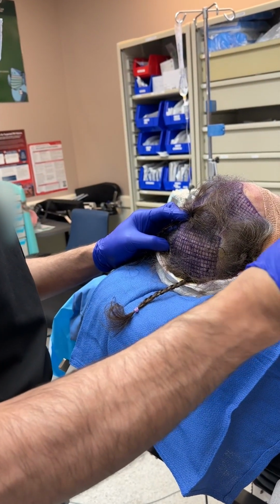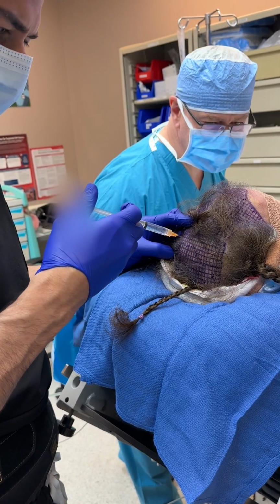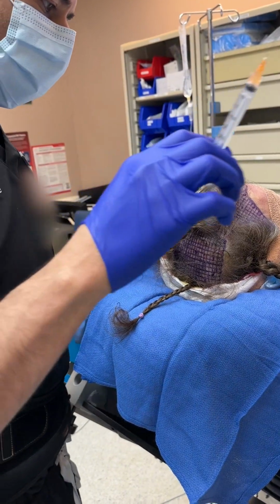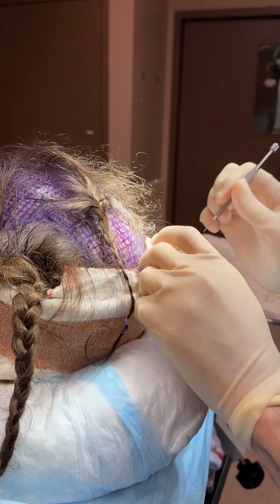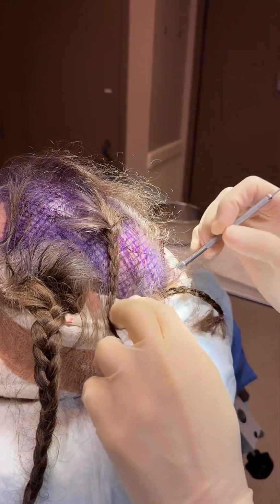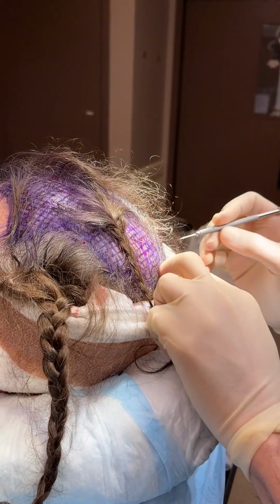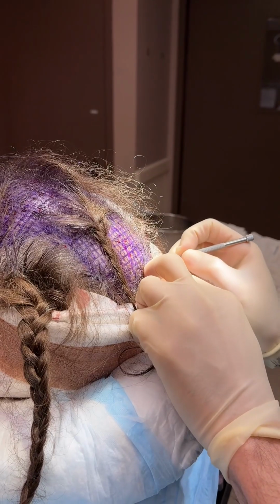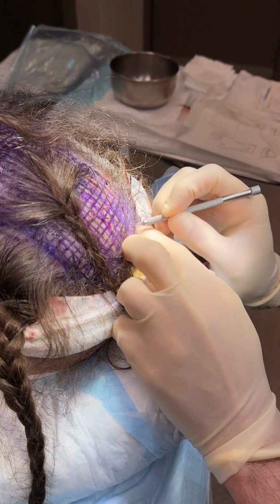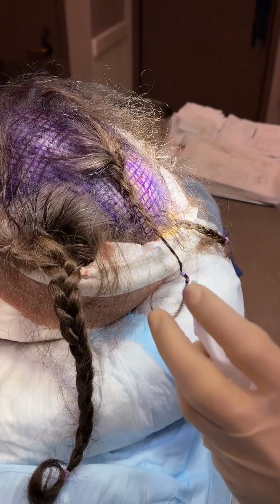So by making a grid and putting a specific number of grafts per box, we feel we get the best results. A big deep breath. All right, friends, we're making recipient sites for her grafts. We marked everything. We have a specific grid pattern made where we're going to make a fixed number of holes per grid. We're going to start in the back here. Perfect. Very low bleeding, that's what we want.